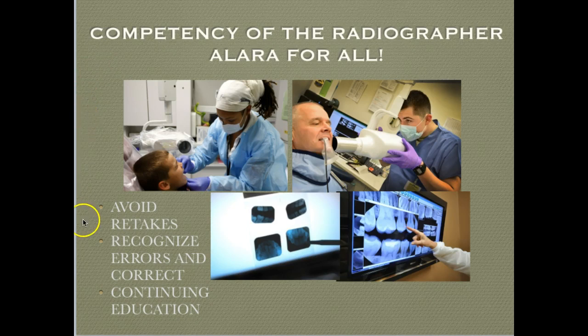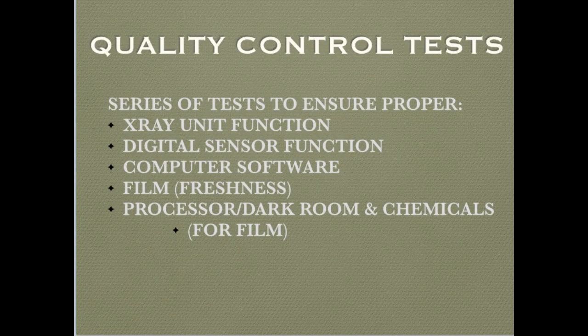We can achieve competency by having really good technique and avoiding retakes. If we have errors, we want to be able to recognize them and certainly correct for those errors. And it's important to maintain your education in dental radiography, whether that's through videos on the internet, perhaps your local dental assistants society offers continuing education. Many of the dental supply companies also have education for the staff. So it's important to keep current in dental radiography practices.